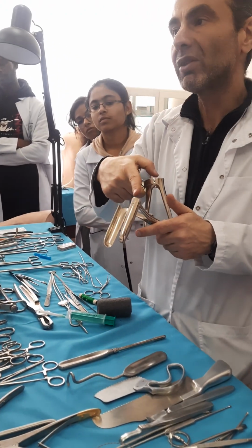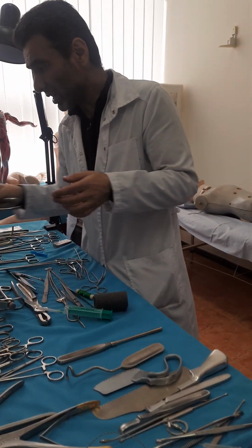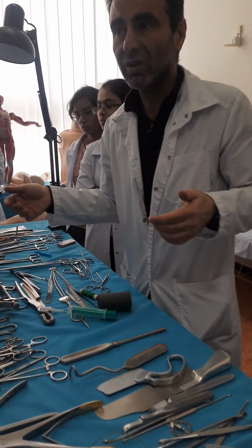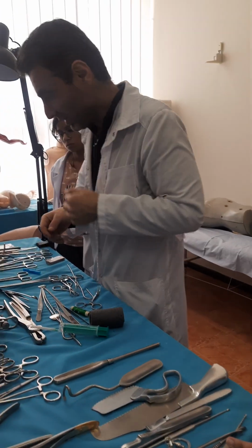Sometimes they don't have enough light to see much better, because it is not a very visible region. That's it. It is an enlargement of the natural apertures to make proctological, gynecological, and different kinds of manipulation.